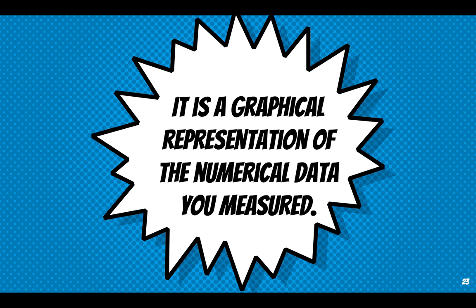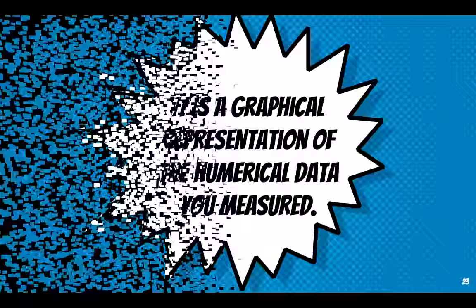So, isn't it that you have your automated cell counter when it comes to hematology? So, I will not be digging too much about the principle of those machines yet. But what we're trying to discuss here is how are you going to make sure that there is a stability of your machine, the quality of your reagent, and also the technical staff. So technically, we can make use of your histograms. If you're running your samples, you can assess the run according to its histogram or according to its scatter plot. So let's move on.